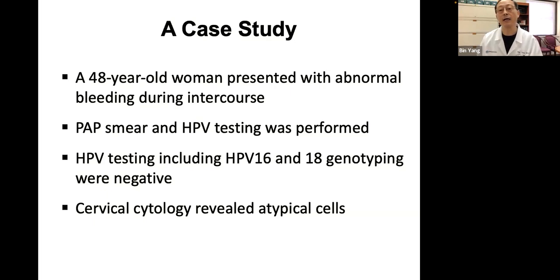That could not be done until HPV testing cost dropped. 5 years ago, we were working with one testing company in California, and we applied that over there. And there's also a home-brewed HPV test in China that does not use electricity or running water, you just test. The sensitivity is compromised by about 7%. When you have a built lab HPV test, you need a set up lab, but that one is portable.